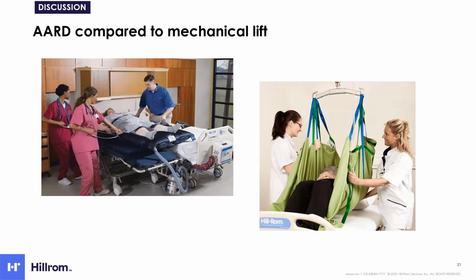Here I have a comparison between the AARD and the mechanical lift. On the left, this is the AARD. When using this AARD to move a patient, it needs to be placed under the patient first, then connected to a blower and inflated before use.